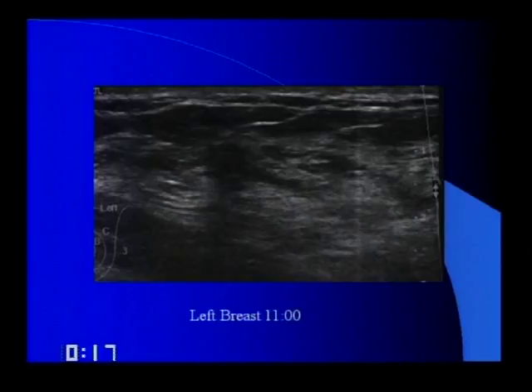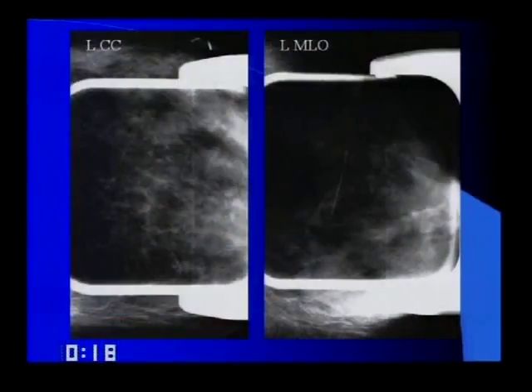And right here, what do we have? You have a hypoechoic mass with irregular margins. Right. It's shadowing, and it's a suspicious mass. It's a suspicious ultrasound finding. I go back to this mammogram, and I still, even though I know where it is, at 11 o'clock, I don't see it really. But I bring her back and do a digital mammogram of the left breast. And right here, there's another area of architectural distortion on the CC view that I don't see very well. It's right in here, close to the scar marker.